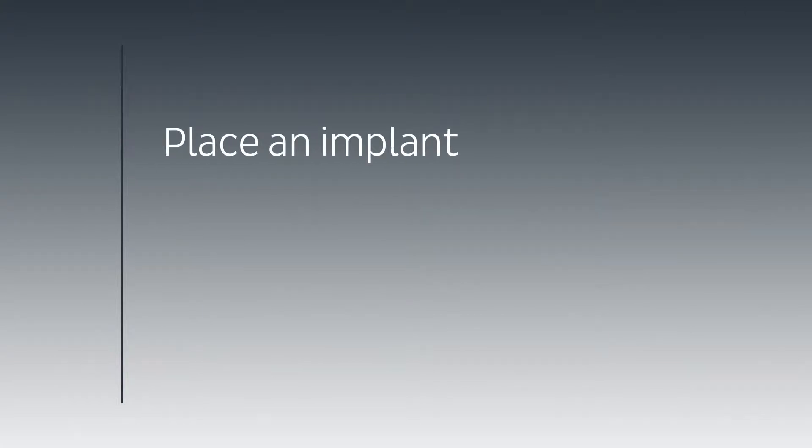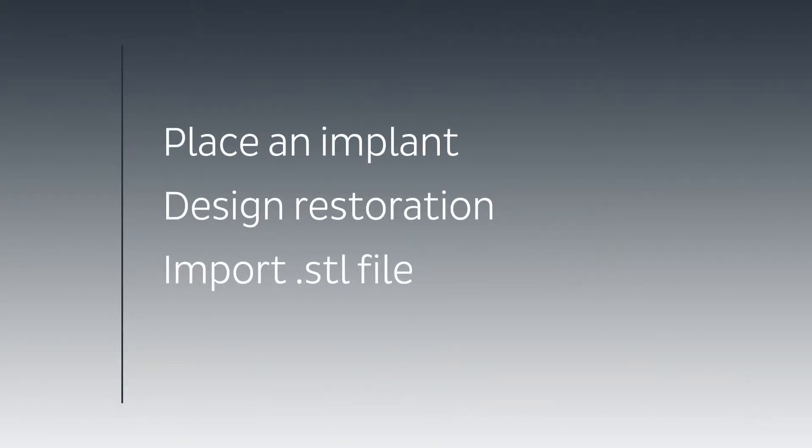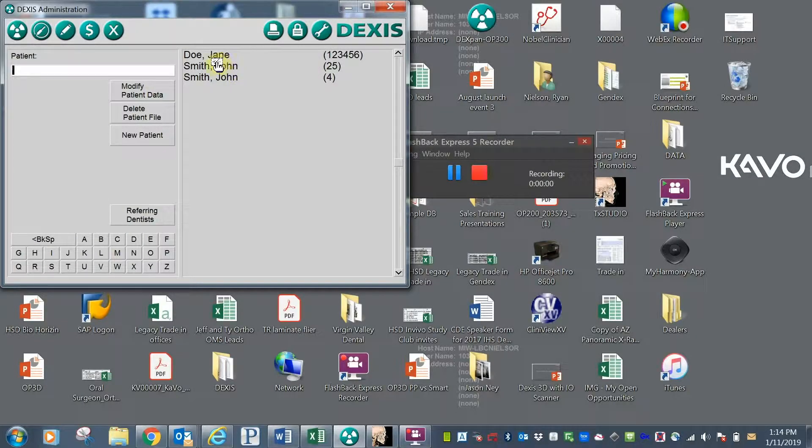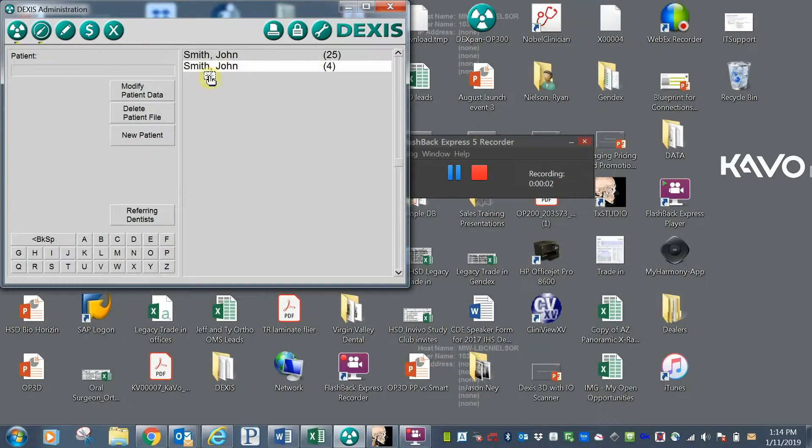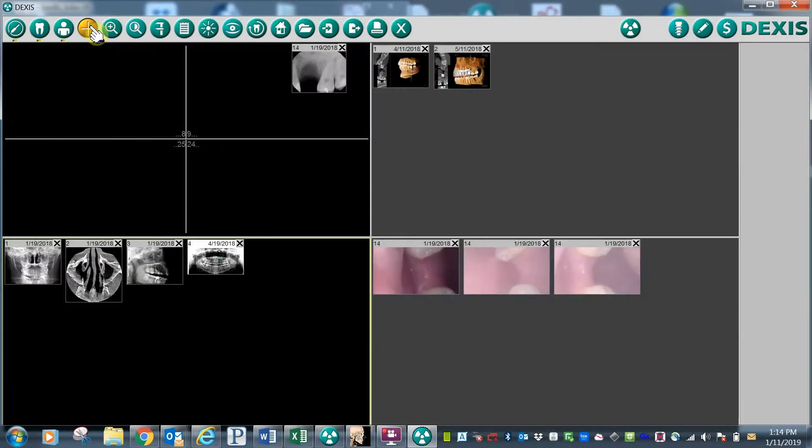We will be showing you how to place an implant, design your restoration, and import an STL file from any open-source digital impression scanner. To get started, simply open your practice management or imaging software. In this example, we are using DEXIS software.